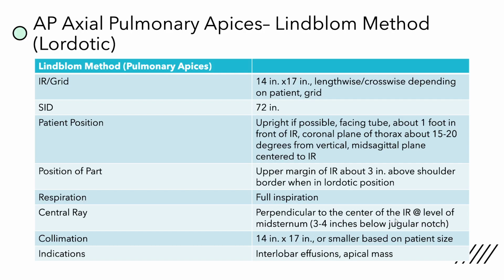Anytime you're touching the patient, whether it be the inferior angle of the scapula or the sternum in this case, which is a little bit more invasive in their space, you're going to want to ask them for permission and let them know what you're doing. So I'm just going to be palpating your sternum here, so it helps me find exactly where to put the x-ray, so we make sure we get a nice clear image of your chest. That's generally what I'll say, and I'll ask them if that's okay, and generally they say yes.